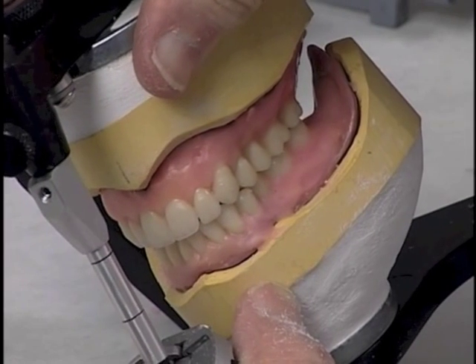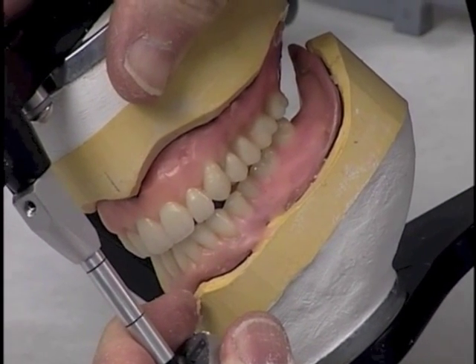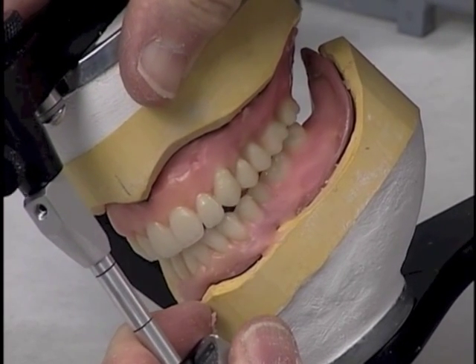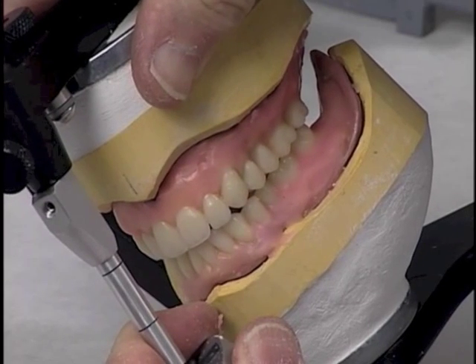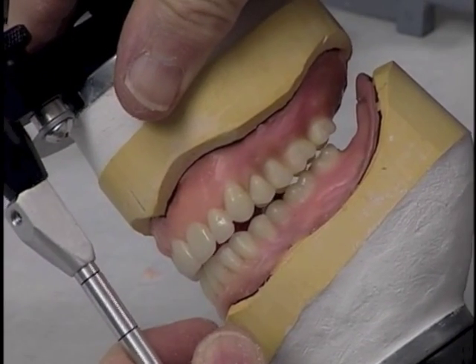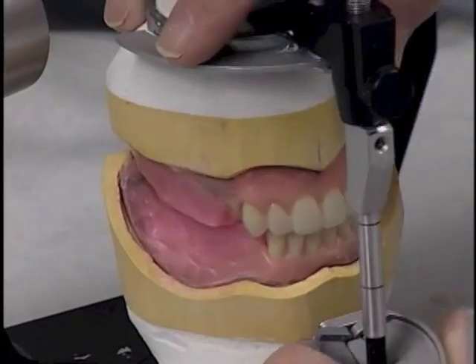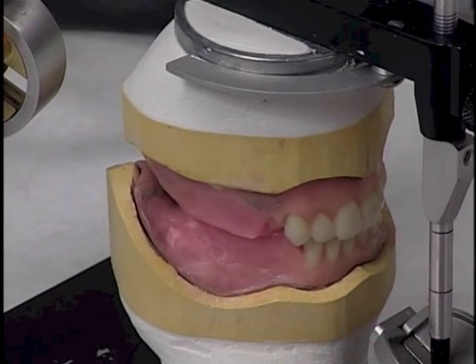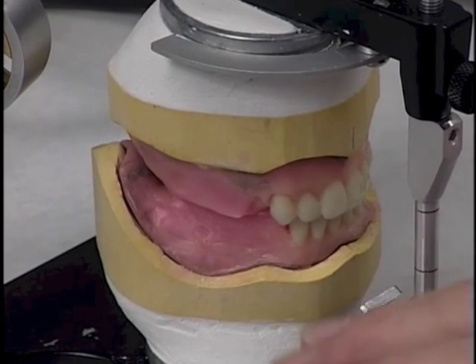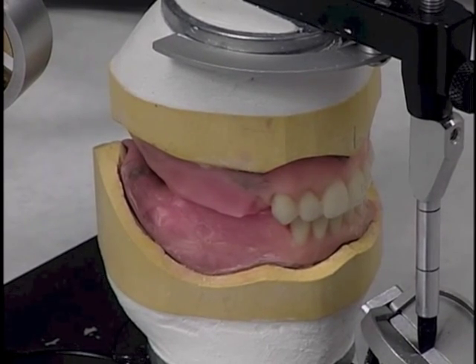When we put it into non-working, we have nice balancing contacts on each and every tooth from the first molar all the way through the second molar. So from here, we will be ready to arrange all of the teeth on the patient's right side, and then we should have a good cross-arch balanced occlusion.